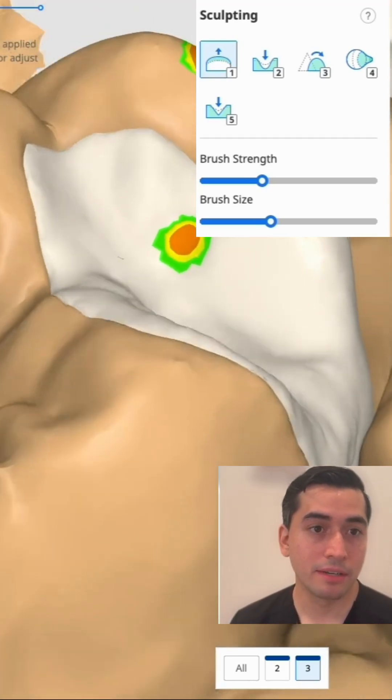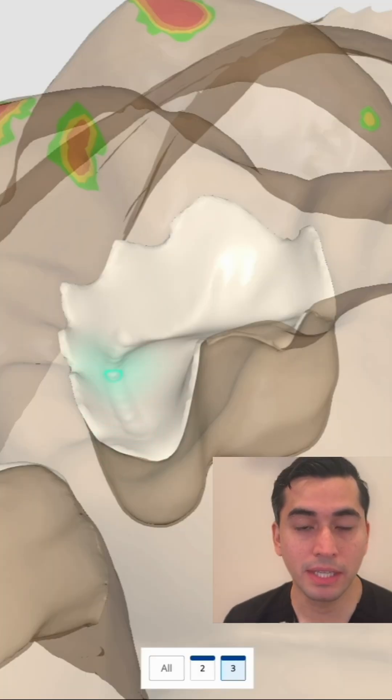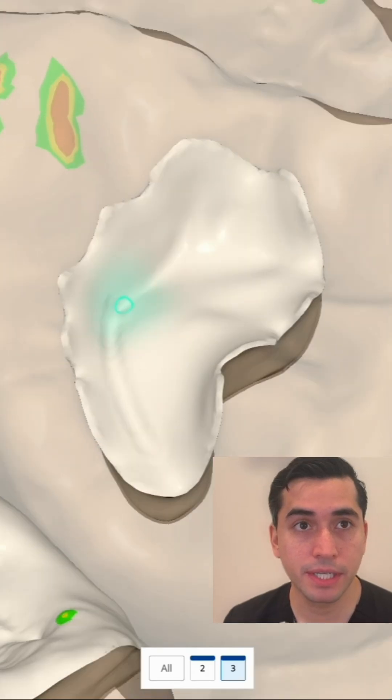You'll see me work on that transverse ridge, work on the contacts, and create these deep fissures here.